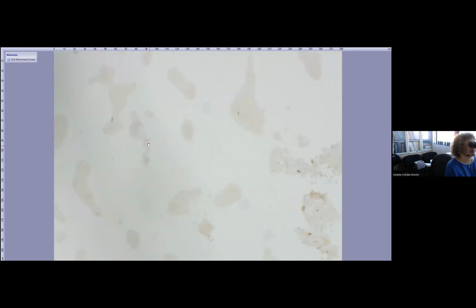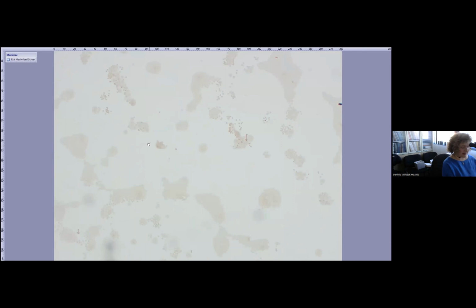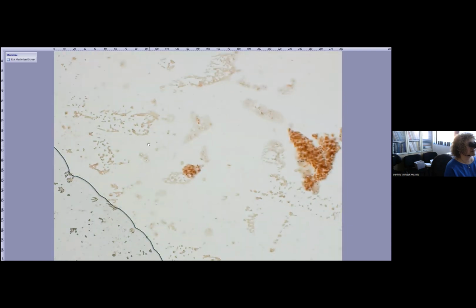If we declare it negative, this is 1A stage of the ovarian tumor, and this is so important for the further therapy for the patient. So PAX8 was negative, and also WT1, it was all. Oh no, this one was a little, sorry, this was positive.